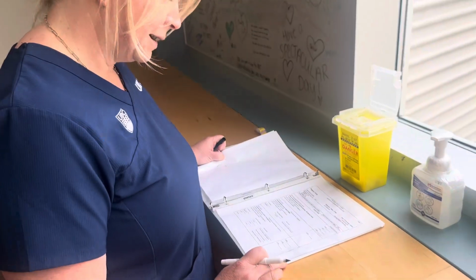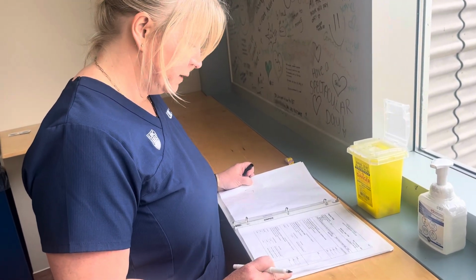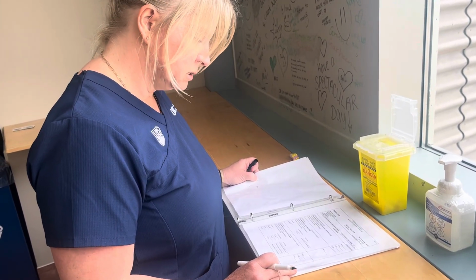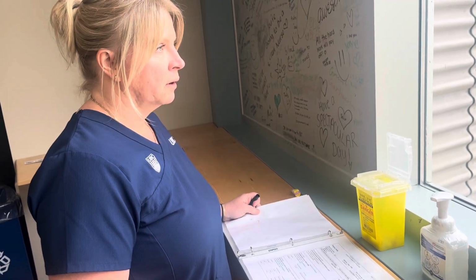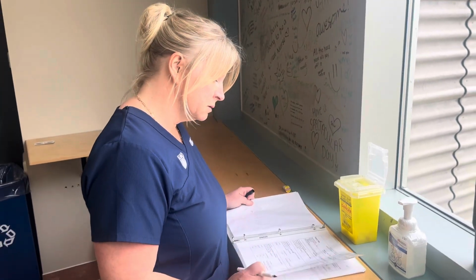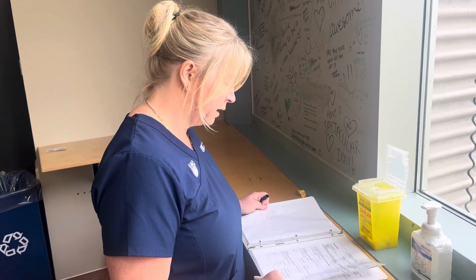This aspart is a fast-acting or rapid-acting insulin indicated for diabetes. It is a high-alert med. It's rapid onset, so probably about 15 minutes onset. Peak is about 1 to 2 hours.